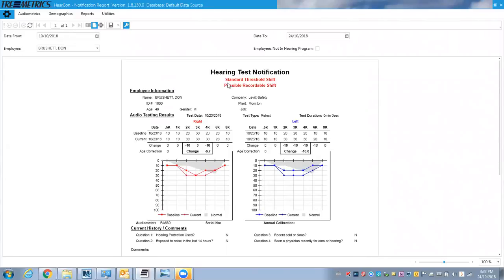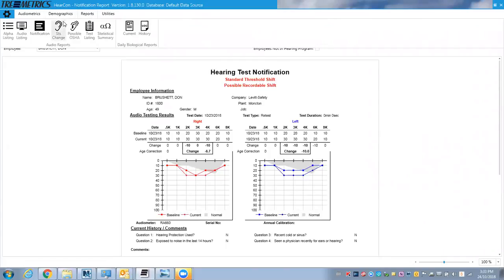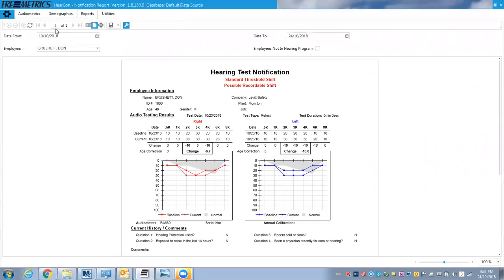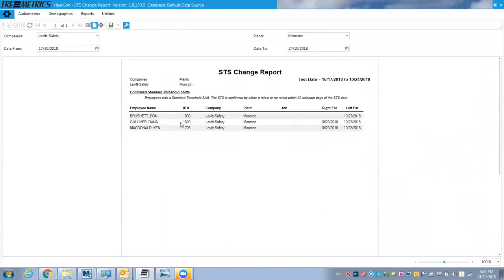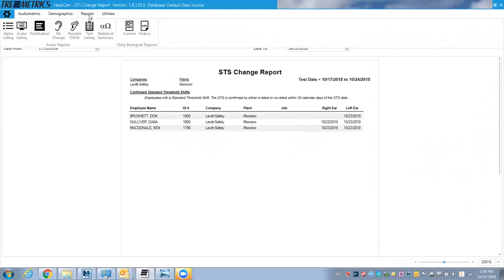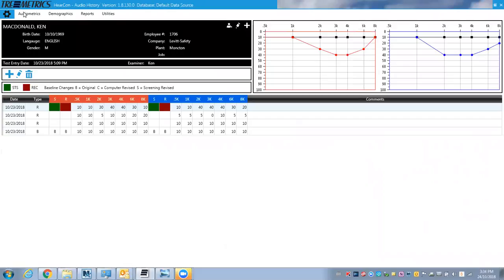So there's a standard threshold shift, possible recordable shift on some of the test data that I put in. STS changes. You can see that because of the data that records when it happened and who had those shifts. So that's kind of a quick overview of the software and some of these are some of the results from the past and you can see it graphically here as well.